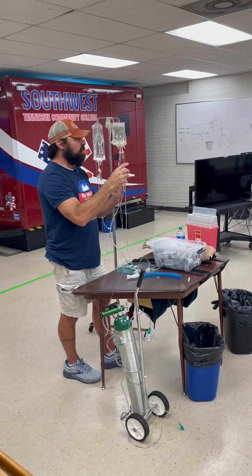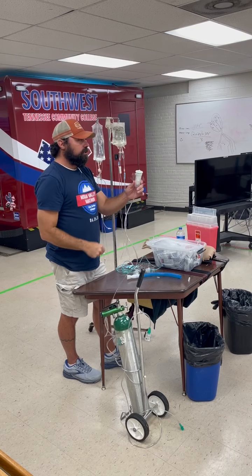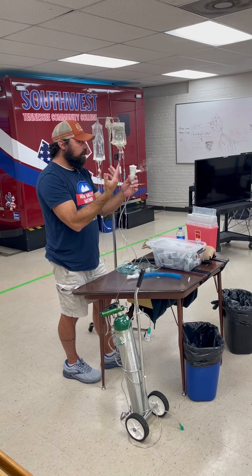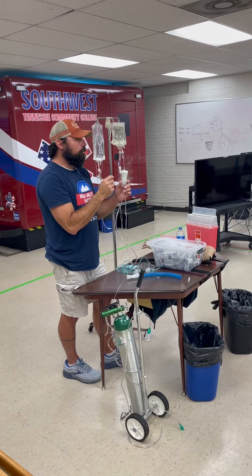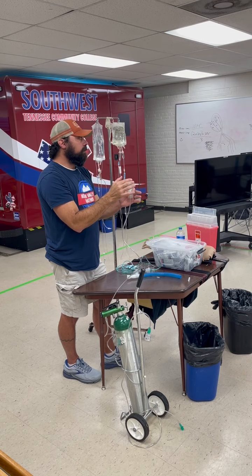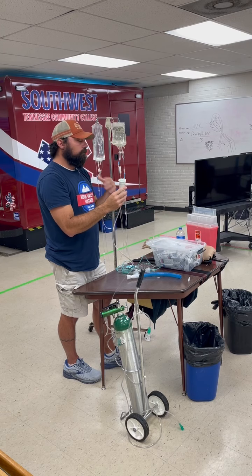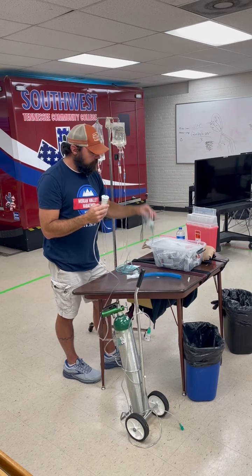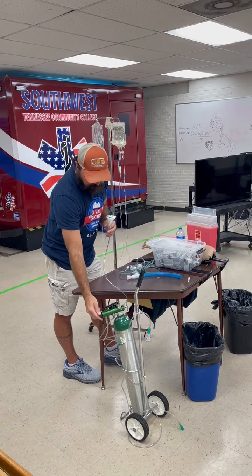Now, let's say they're too weak and they really can't draw in that deep. You can override it by just twisting that, and now it's a continuous flow, so they can breathe in naturally. Again, they have to still be able to hold this for them to be able to use it. So let's just say they're too weak, the respirations are just, they can't do it, all right? So you need to help them out a little bit. That's why we have this mask.